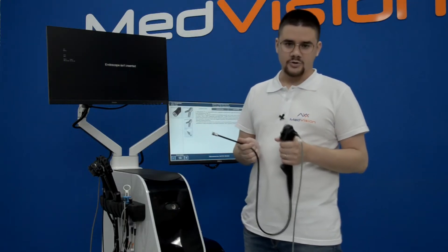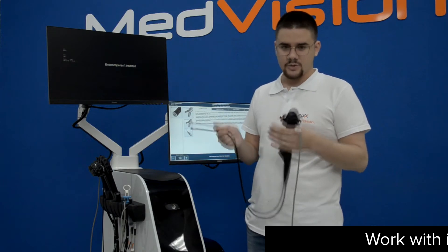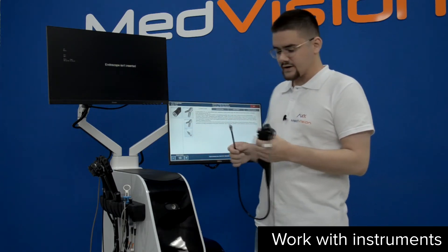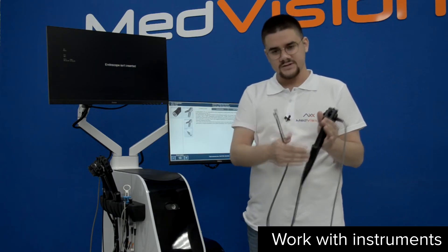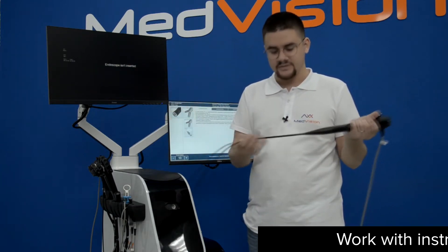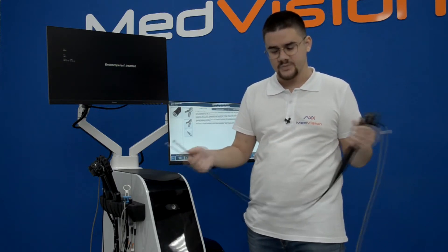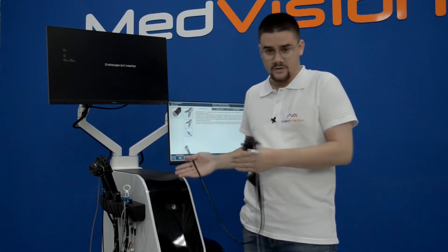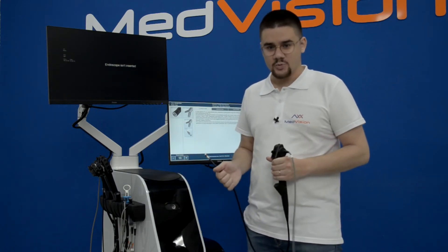Let's have a look at the actual operation of the simulator. I'm holding a bronchoscope for the purpose of this demo. This is an exact imitation of a real instrument, but the flexible part has been taken from a real instrument, so all of the techniques and methods you would normally use in real life are possible here as well.